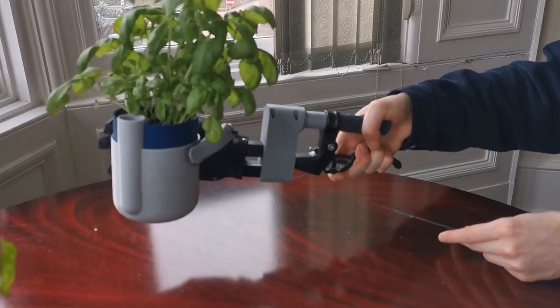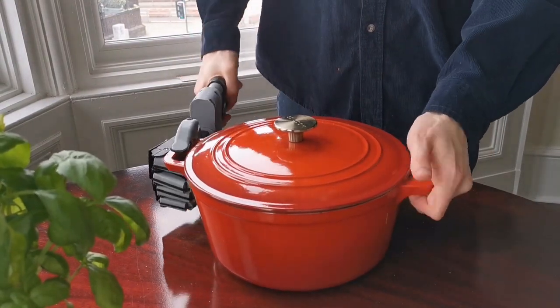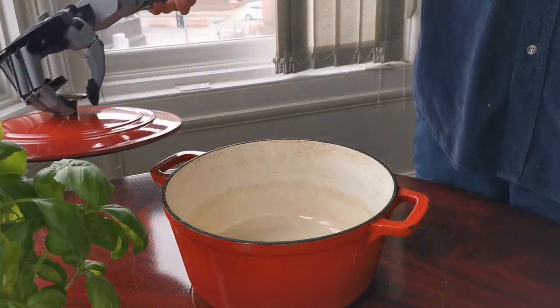We know that different objects require different grips, and that's why we made switching between them so easy. It can even pick up heavier objects like this cast iron pot in a lateral grip — and it's a quick switch — and it can lift the lid in a tripod grip.